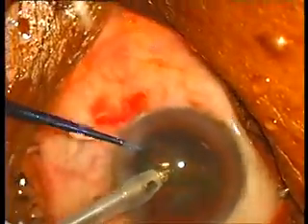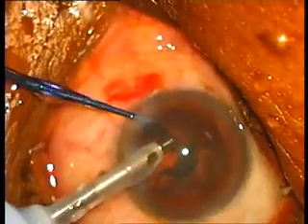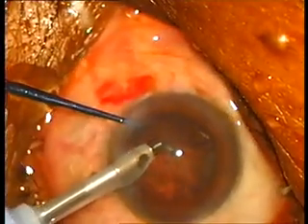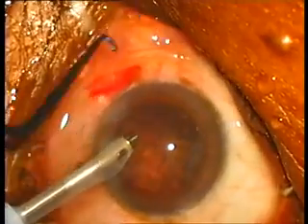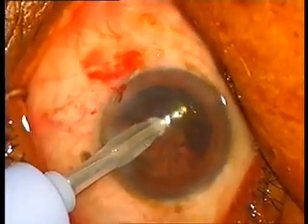As you see, I have removed the nucleus, now the epinuclear complex I'm trying to remove. I use the same setting throughout the procedure, like pulse Phaco. Maximum power setting is 60. I keep the power setting at 60, and vacuum is about 300 millimeter of mercury.